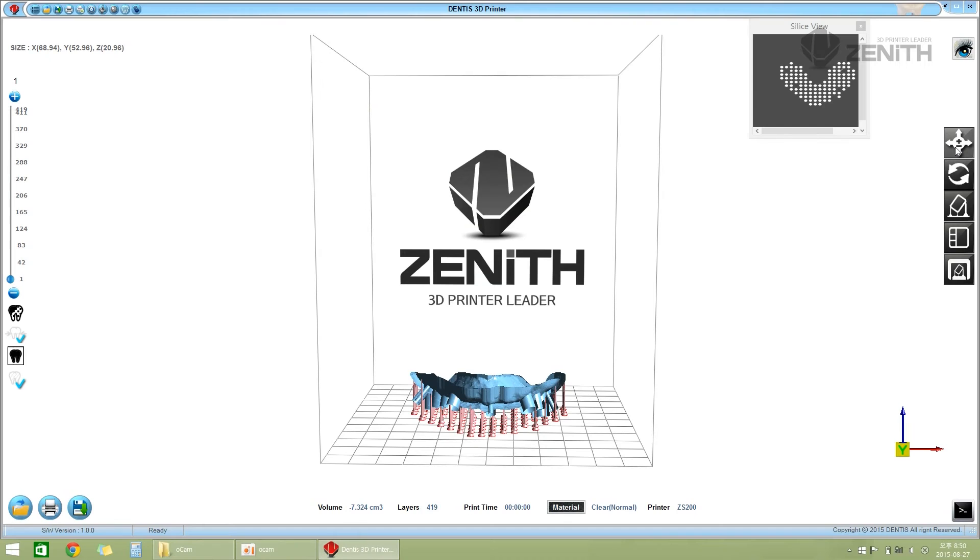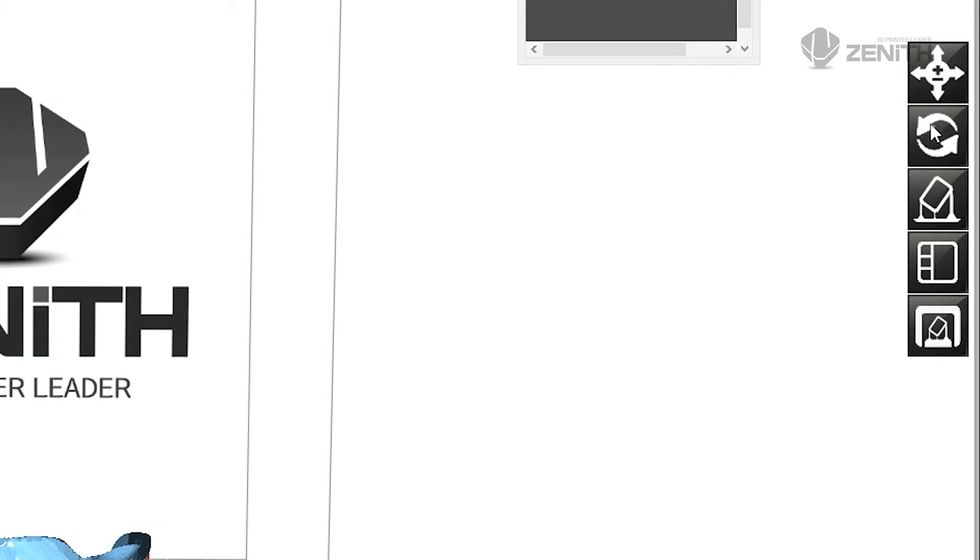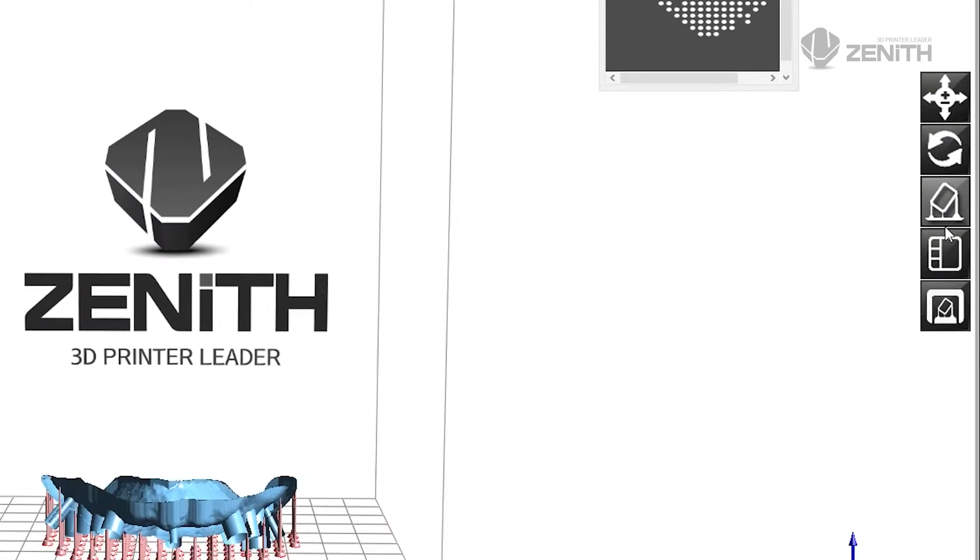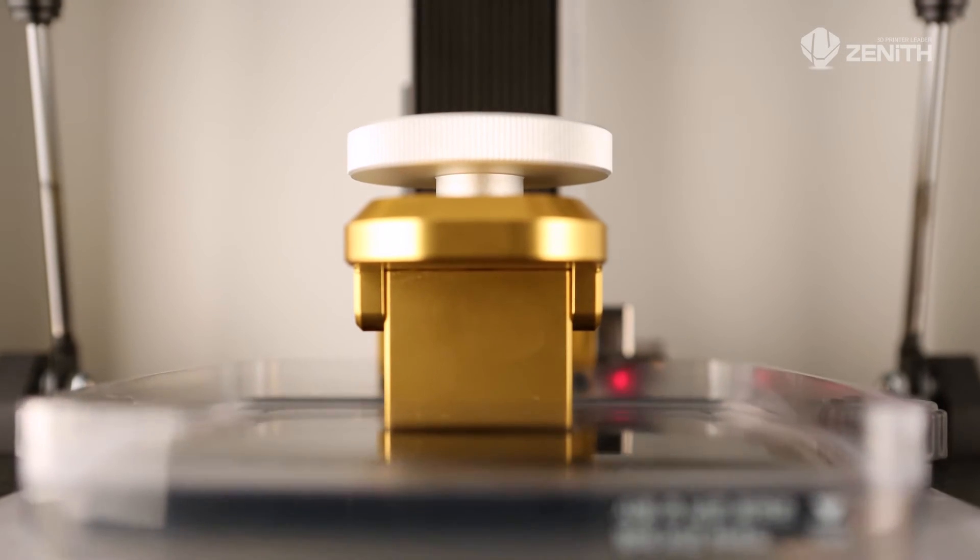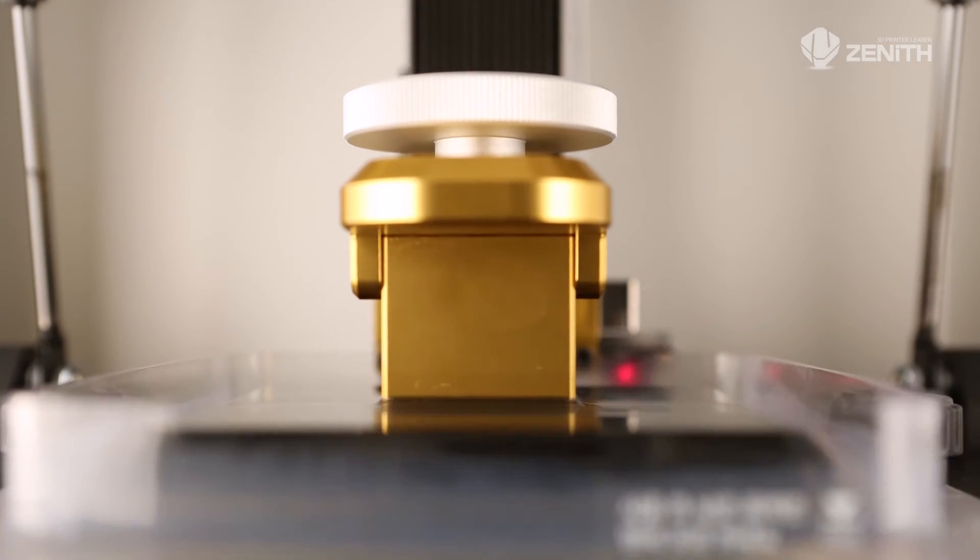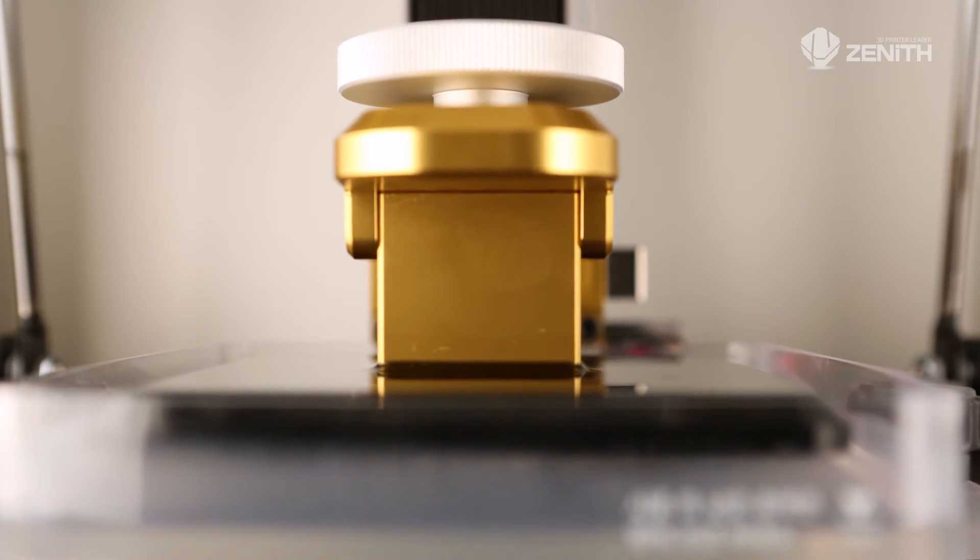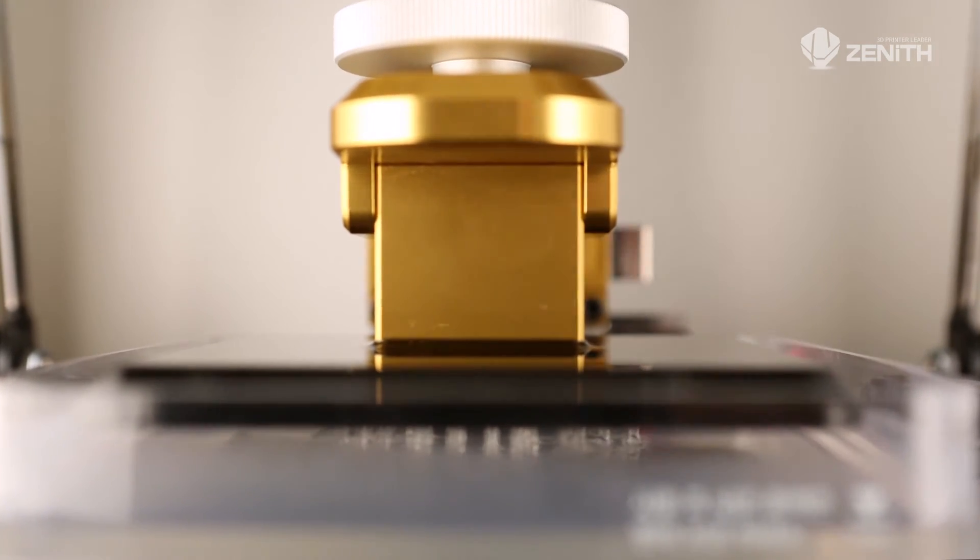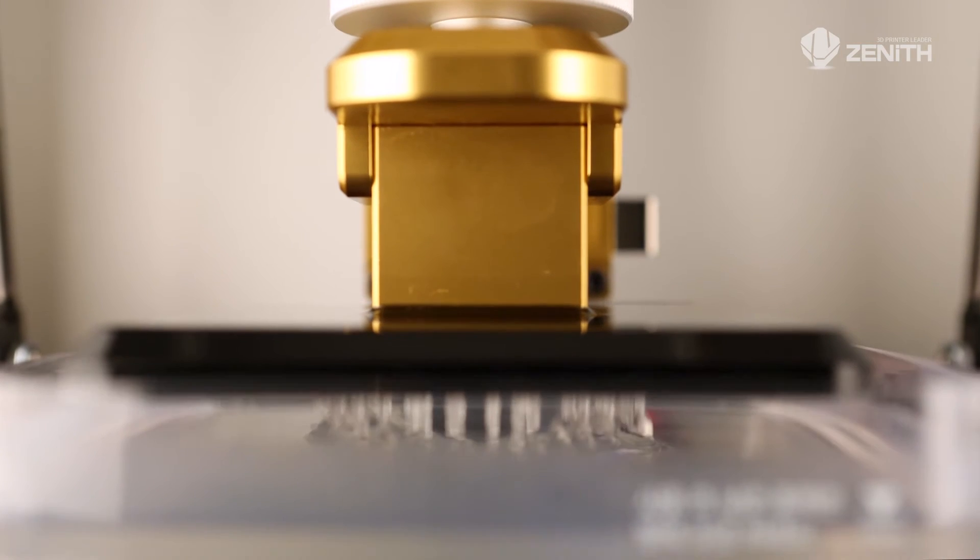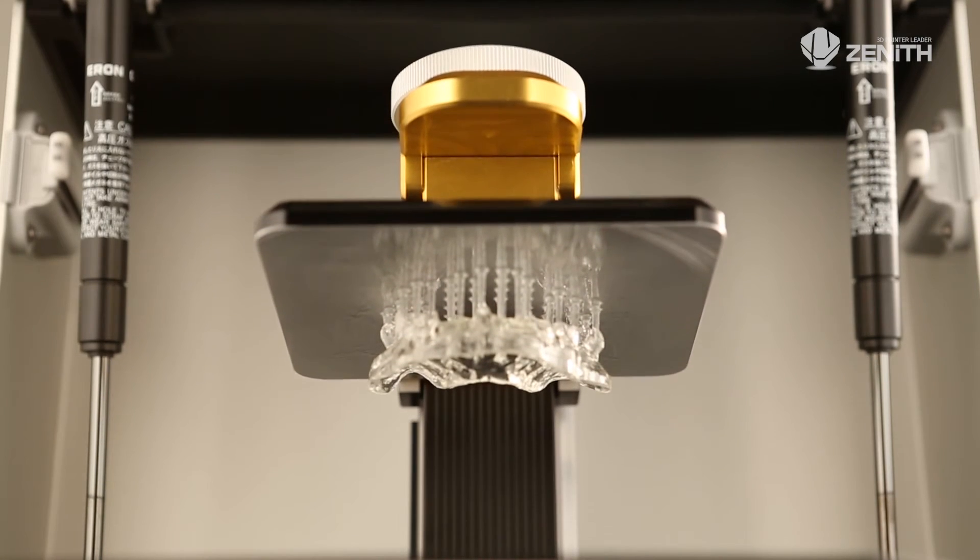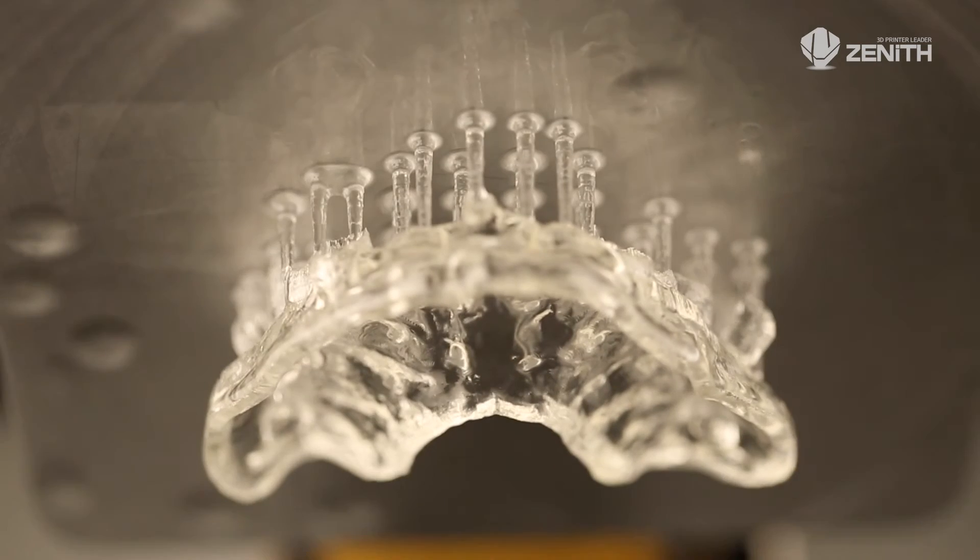You can set up many things from various menus of the Zenith program. Now you can see the accurate printing result of Zenith, which uses SLA technology. Please wait until the printing is completed. If the printing is completed, the model will be raised automatically.